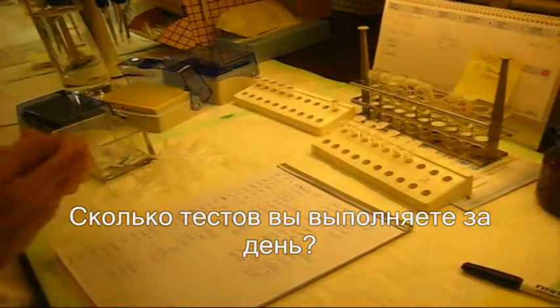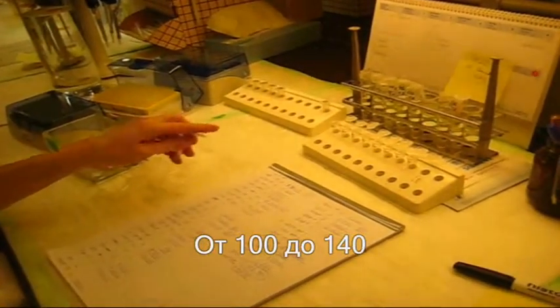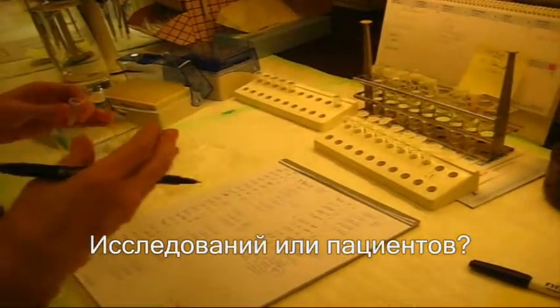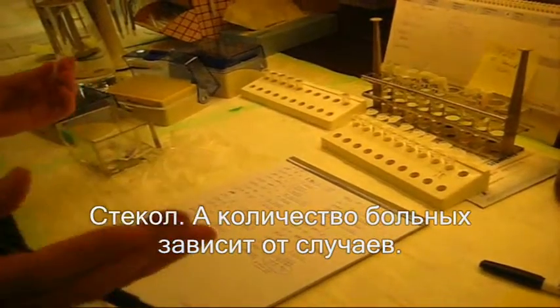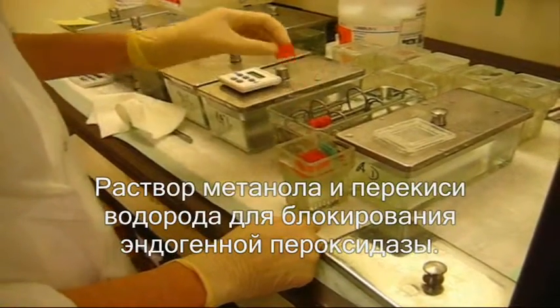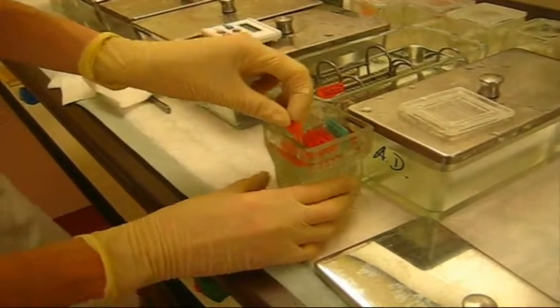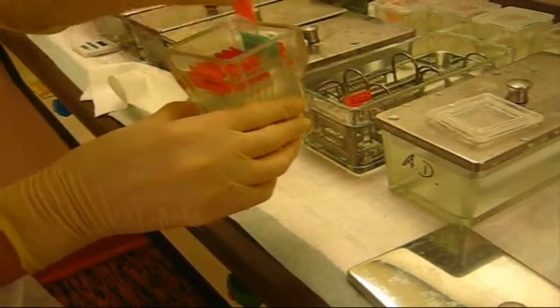How many tests are you doing during a day? One day — one hundred, up to one hundred forty tests. But the number of patients is more; the same patient can have multiple slides — it depends on the cases. I put it in the methanol peroxide solution to block the endogenous peroxidase.